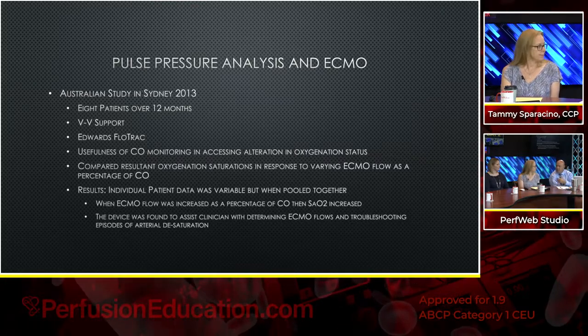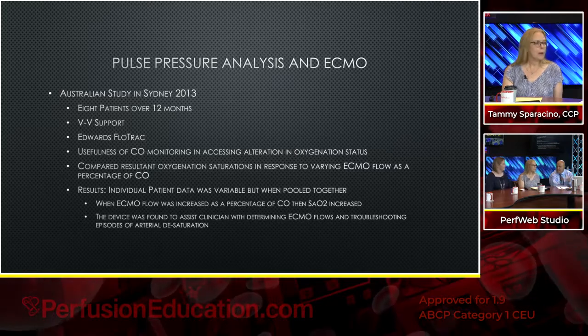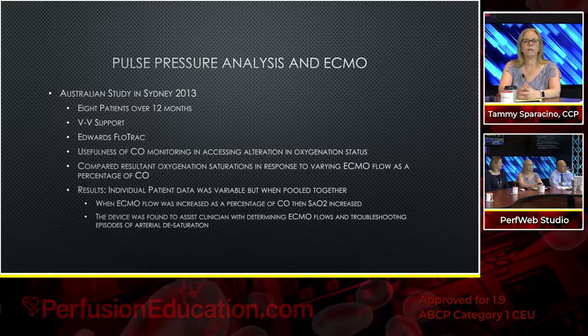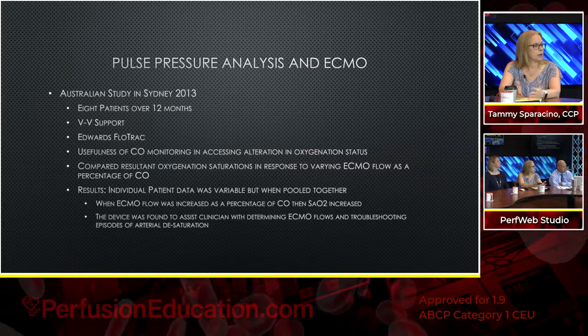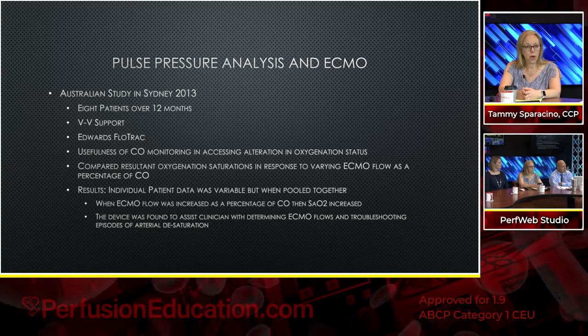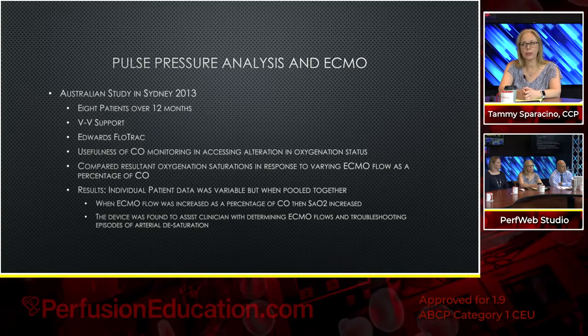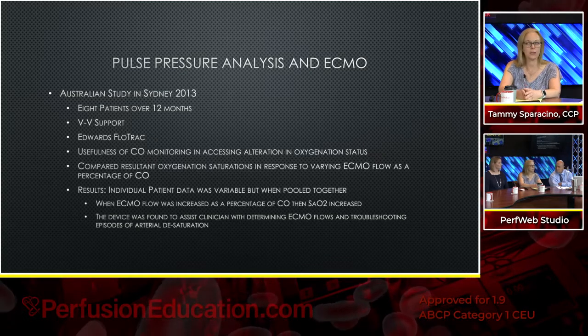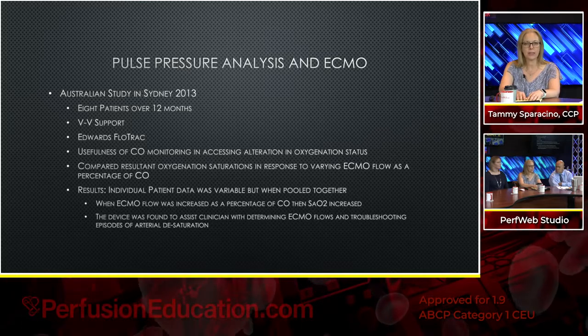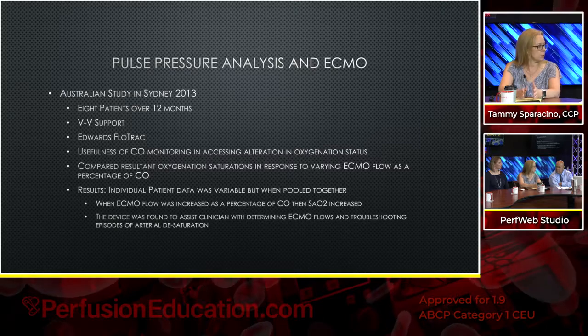Vis-a-vis ECMO or VAD or Impella or balloon pump. And as I was saying earlier, a lot of the journal articles that I was reading did caution that you need to look at the big picture when you're looking at these numbers, when you have these other devices in. But I didn't find a lot of studies where this was their purpose. This is what they wanted to find out.